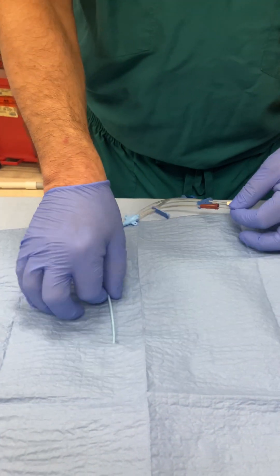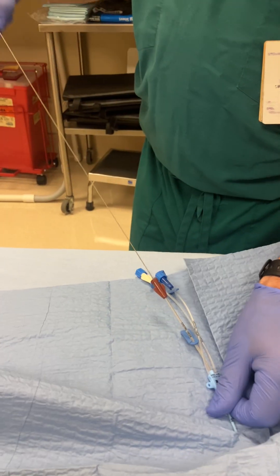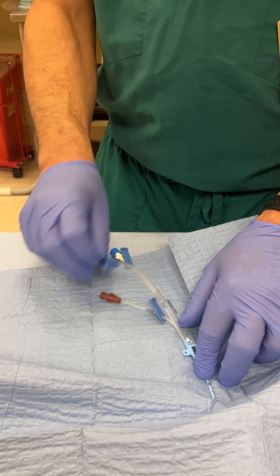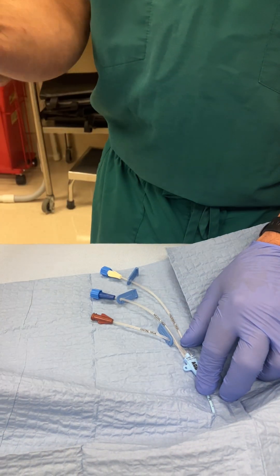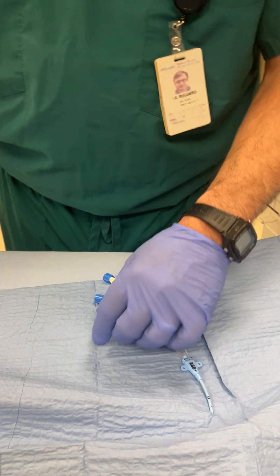I'm going to go ahead and advance the catheter. Now that the catheter is advanced, I'm going to remove the wire. You're going to see a little bit of blood coming up. Nurses will hand you needleless caps to put on these ports and saline flushes. You'll aspirate the air out of the line and then flush the line with saline, and you'll do that with all three lumens.